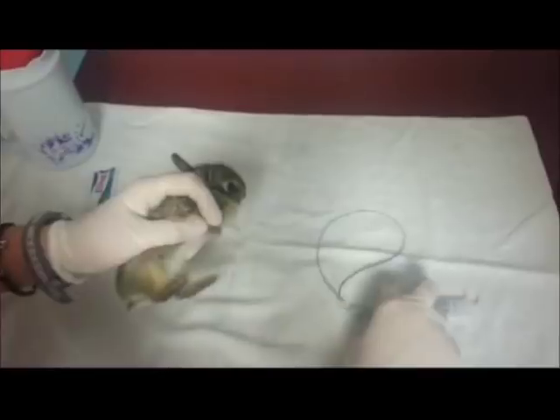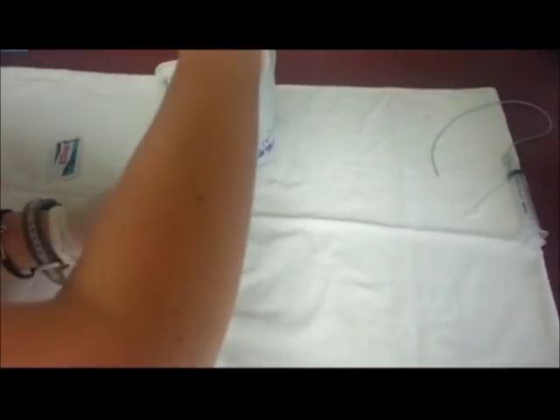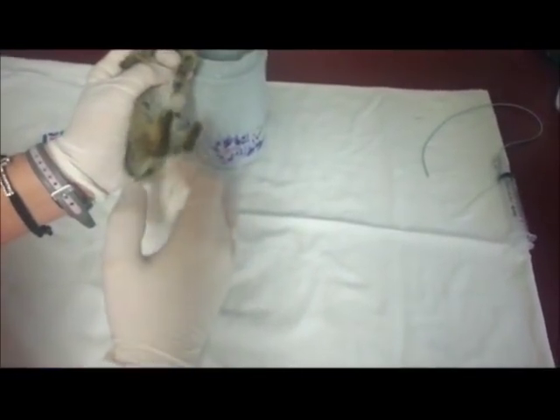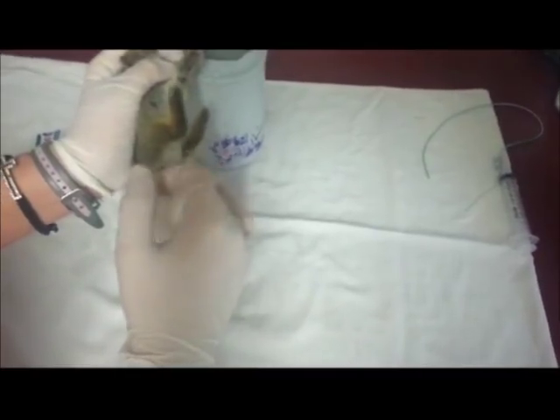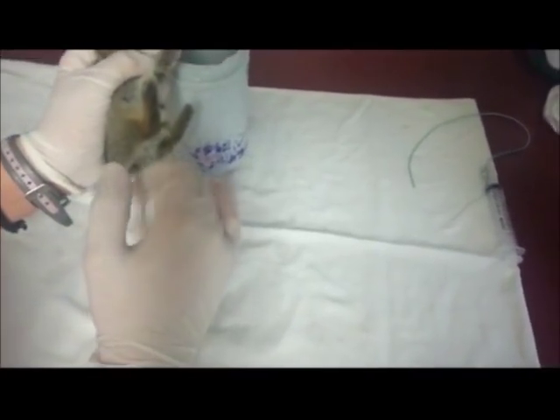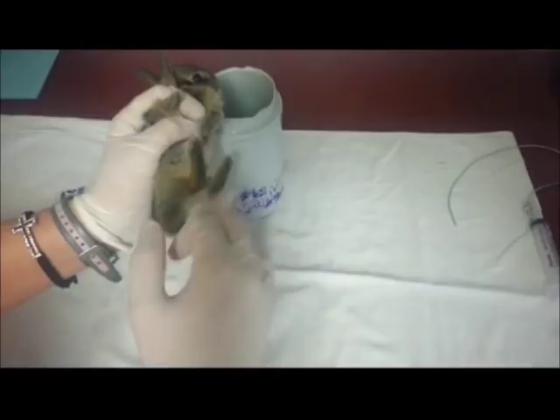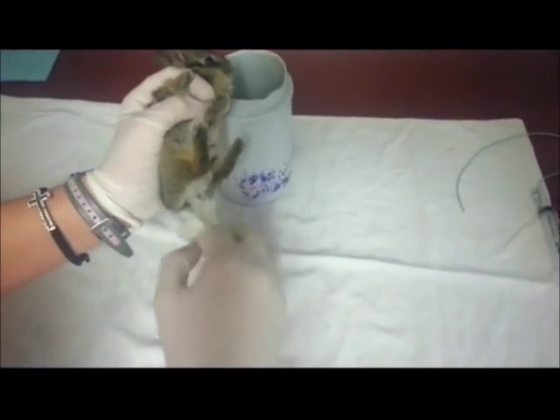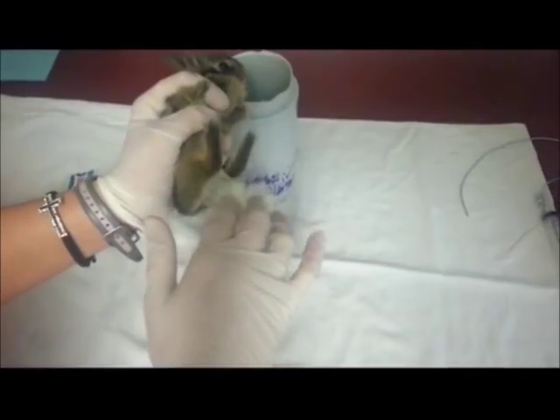Now stimulate the cottontail to urinate after each feeding. Do not hold the cottontails directly on their backs, but instead in a vertically or slightly on their side position. Use a wetted tissue and tickle the genitals gently at a very rapid pace. There should be a steady flow rate since the young cottontails are only being stimulated twice a day with the feedings. When you are finished, place the cottontail into its enclosure.